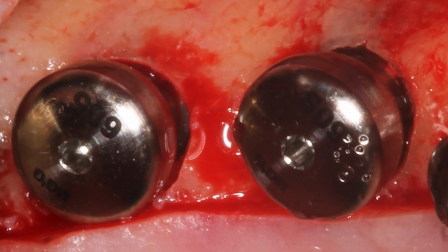Therefore, after a few days, few weeks of healing, and as the bone remodels, the healing abutment all of a sudden becomes loose, and that's just an embarrassment and a practice management situation where patients start to think, what kind of job did he do, she do? Was the implant even placed properly? So the last thing you want is a patient walking into your practice with a healing abutment in their hand. So profiling does solve that issue. You can tightly engage the healing abutment in the desired position.